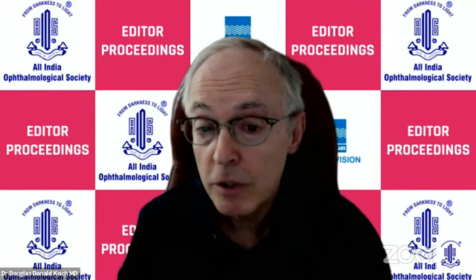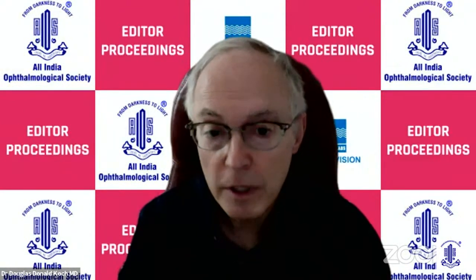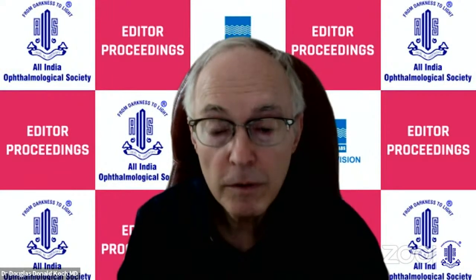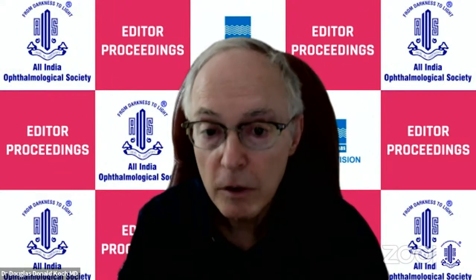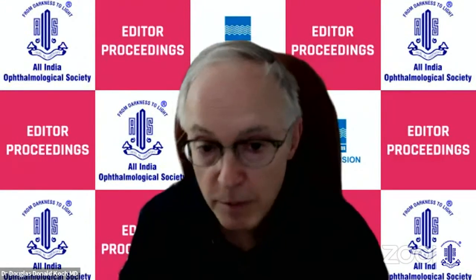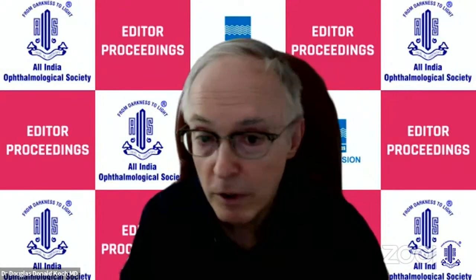Lens optimization may not be as important as we used to think it is, because we're doing so many more things systematically. Now that said, different countries and different races could come up with different constants, and in that respect it might be very valuable. We think that different types of Asian eyes may respond differently from Caucasian eyes, etc.